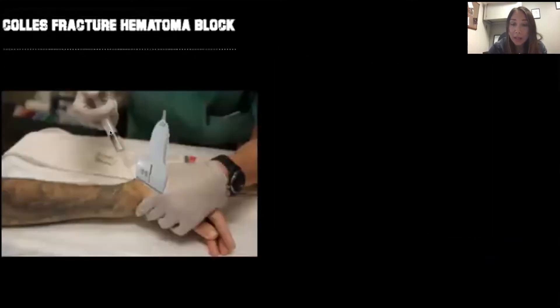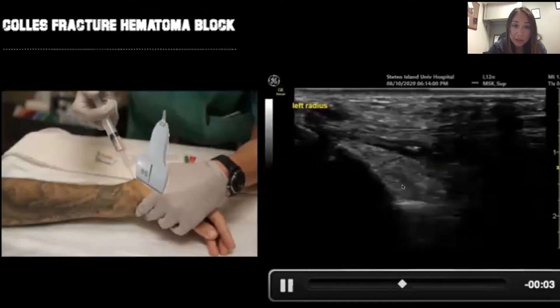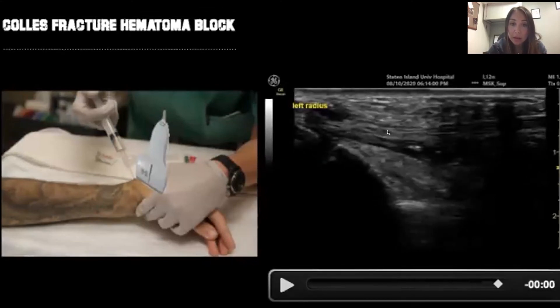We went ahead and performed a hematoma block, where we injected anesthetic right into the area that was broken and dislocated. We used ultrasound guidance to direct the needle into the area, injected local anesthetic, and then completed our reduction.